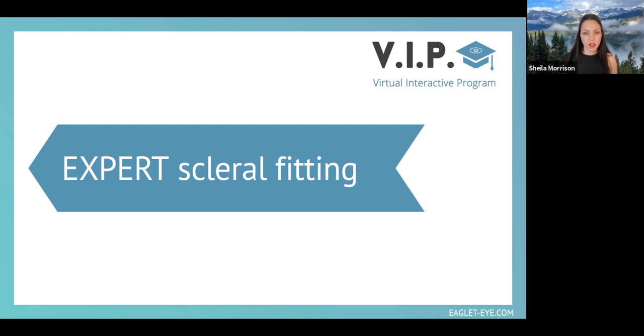We have many great scientists currently investigating exactly what the fog is. There's a lot of lipid in fog. Sometimes patients will wear lenses and report that the lenses are clear when they first put them on. And then after some amount of time, they'll report blur. And you can almost see the fog underneath the lens, just a little bit of almost white debris under the lens when it comes off. That's midday fog. That's very different than the front surface not wetting. Front surface wetting, again, needs to be managed in a different way, and it's usually related to solutions and the chemistry between the tears and the plastic material itself.